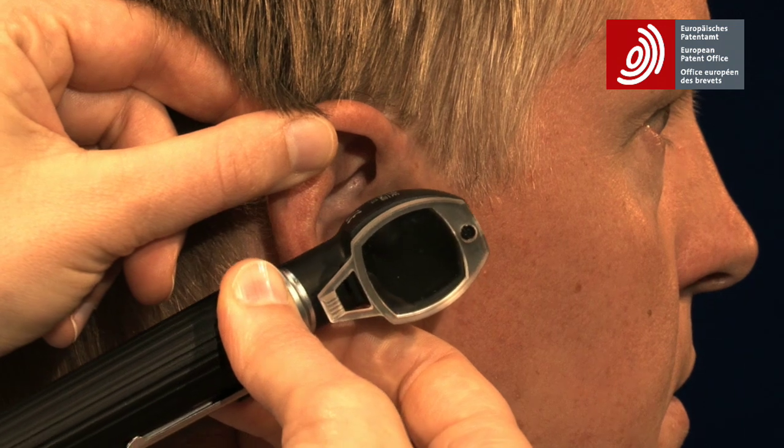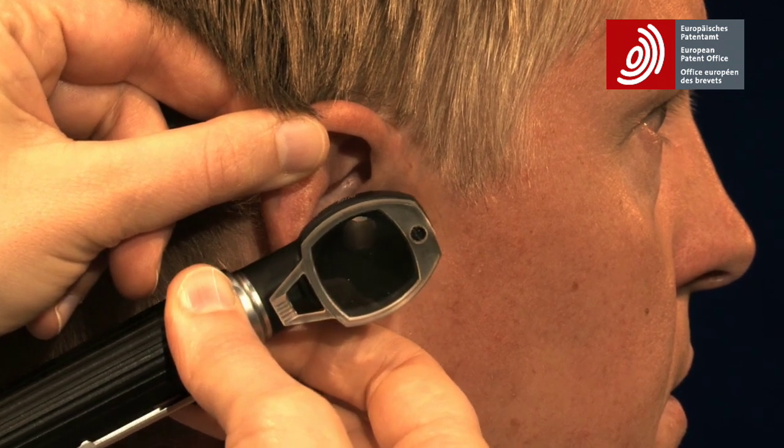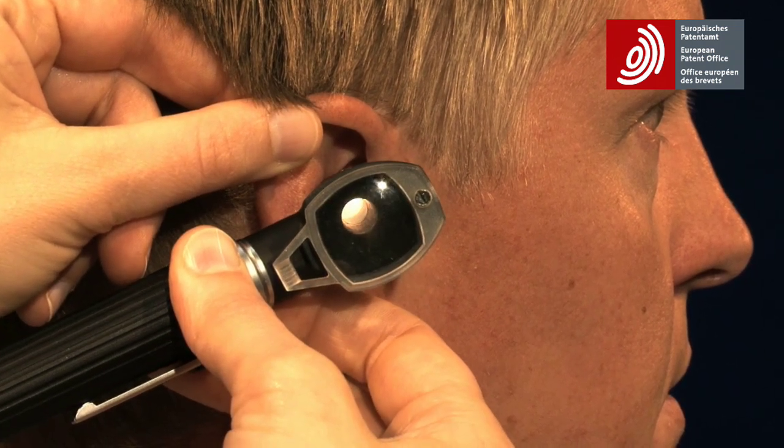They were made by an old process that was cumbersome, time-consuming and not very precise.